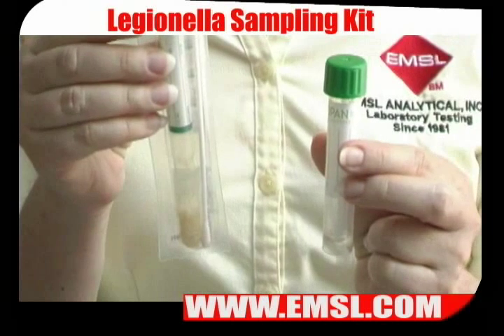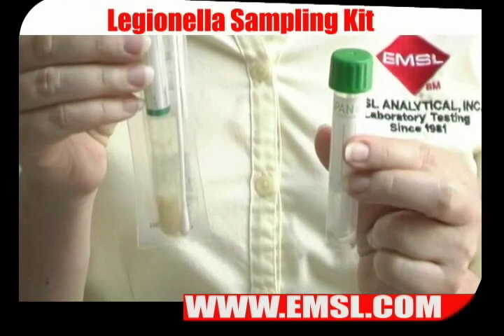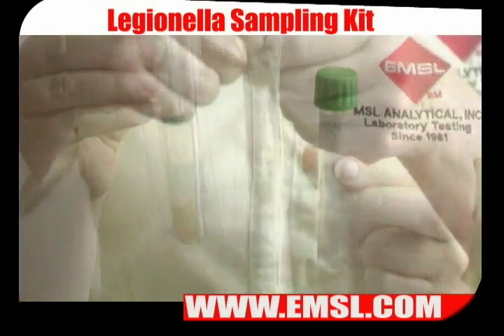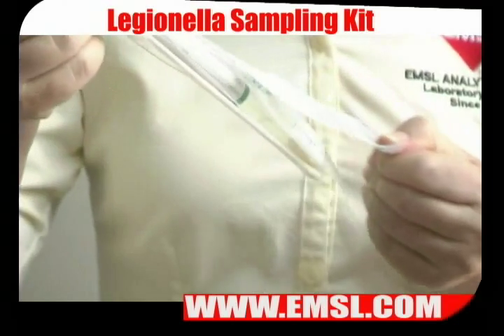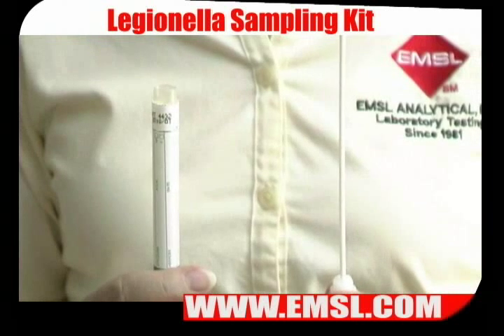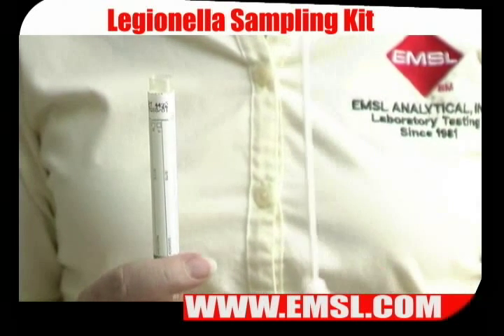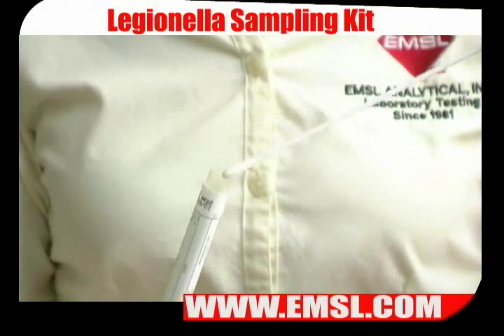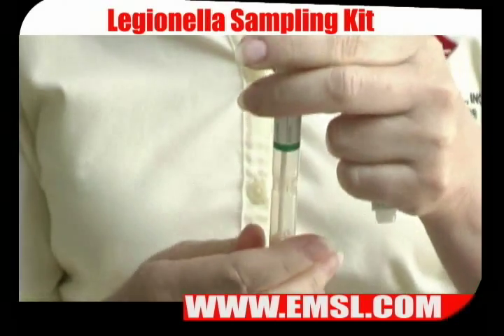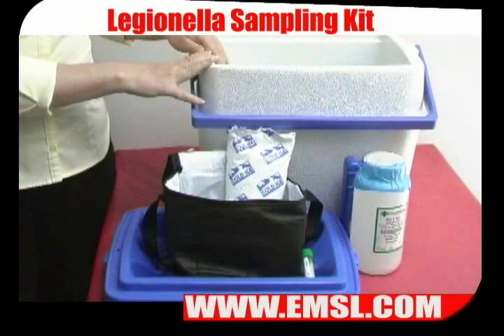If you are taking biofilm samples, you would need to use the swabs. You can use either size — the only difference is the length, in order to reach different sampling areas. Once you open the package, you will see that it comes in two pieces: the swab and the container. To sample with the swab, insert it inside the faucet and rim the inside of the faucet three times. When you are done, replace the swab back into its container, making sure that the lid is sealed. Remember to label the swab and ready it for shipping.